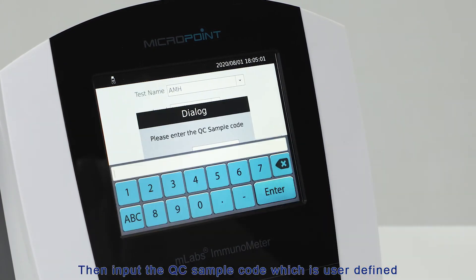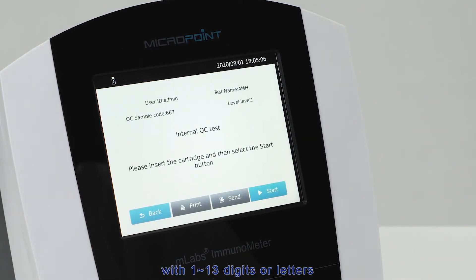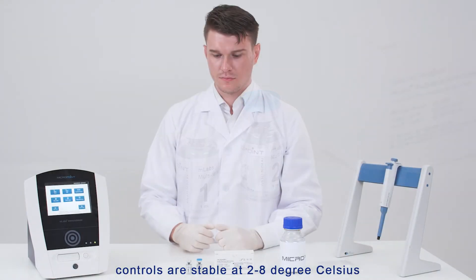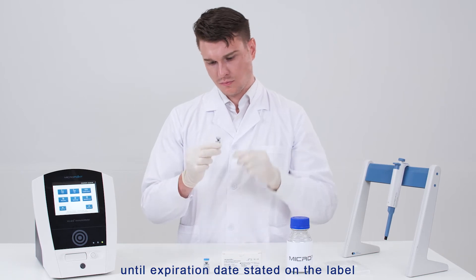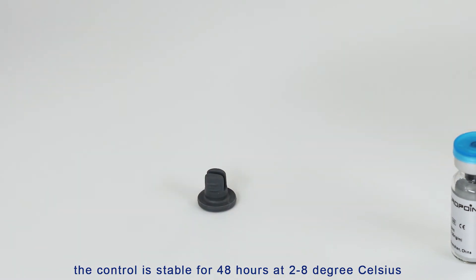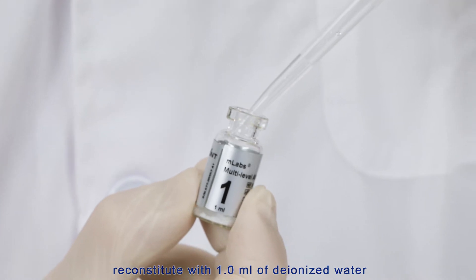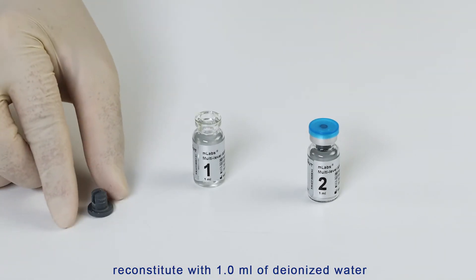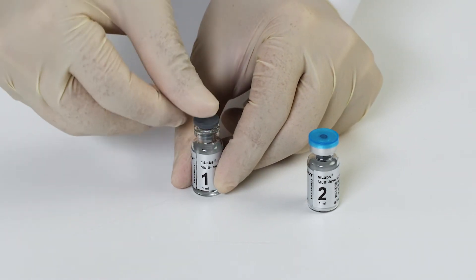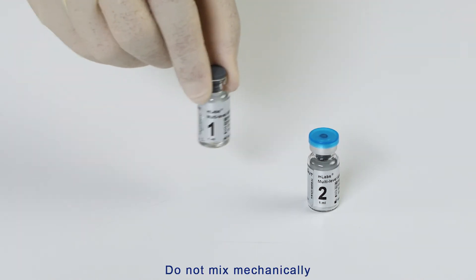Then input the QC sample code, which is user-defined with 1 to 13 digits or letters. Unopened AMH lyophilized controls are stable at 2 to 8 degrees Celsius until the expiration date stated on the label. Once opened, the control is stable for 48 hours at 2 to 8 degrees Celsius. Retrieve the controls from the packaging and reconstitute with 1.0 milliliters of deionized water using a volumetric pipette. Gently swirl occasionally for 10 minutes. Do not shake. Do not mix mechanically.